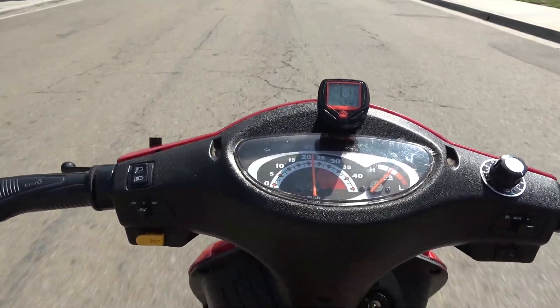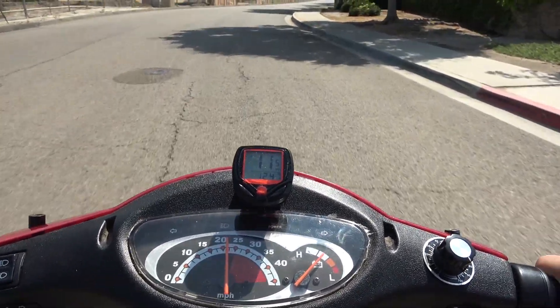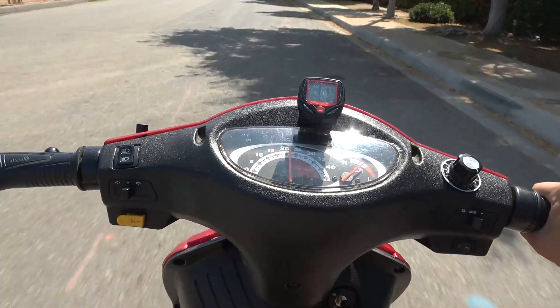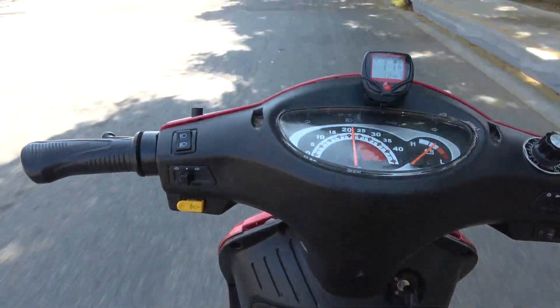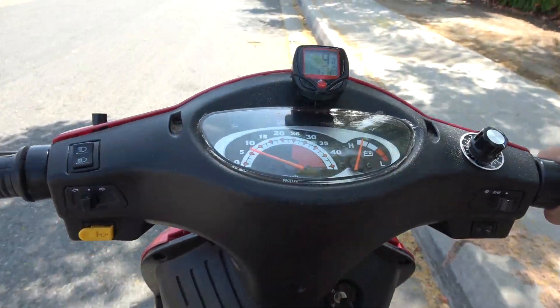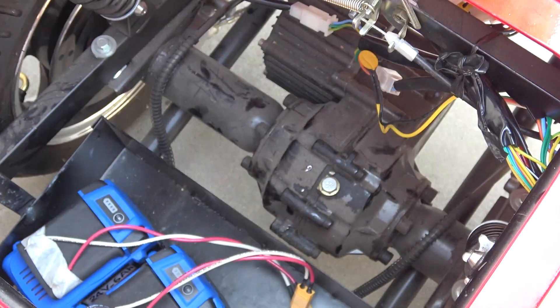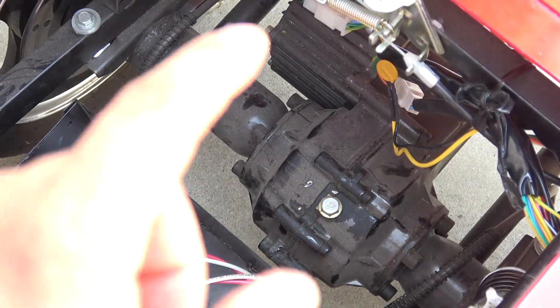That's maximum speed — about 23 miles per hour on the original odometer, but on my speedometer it's only 11 and a half miles per hour, so the original speedometer is really way off. There is also a clicking noise I noticed while testing the scooter — I believe it comes from the rear differential, so there's definitely something wrong with the gears inside. That's something I'll have to repair later.